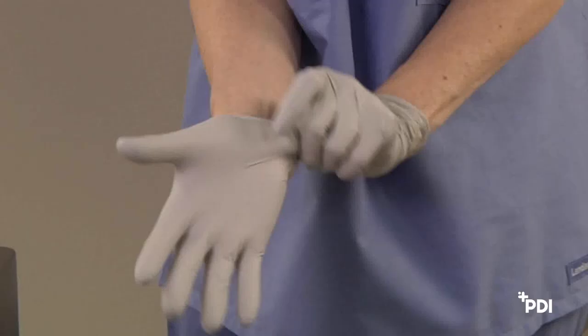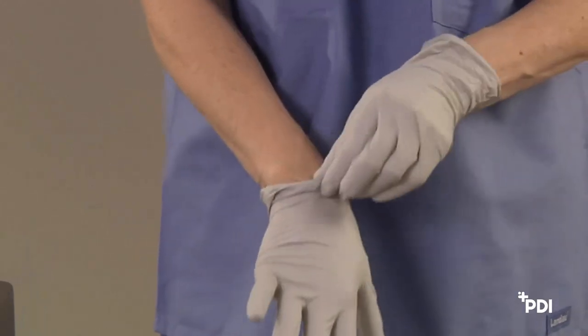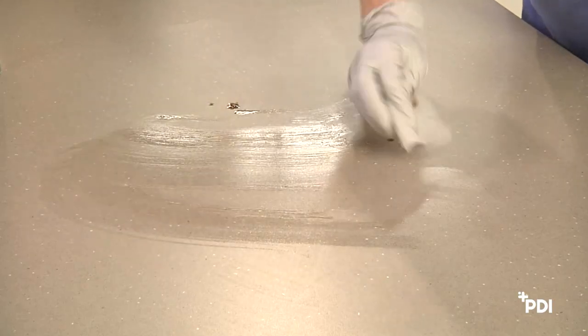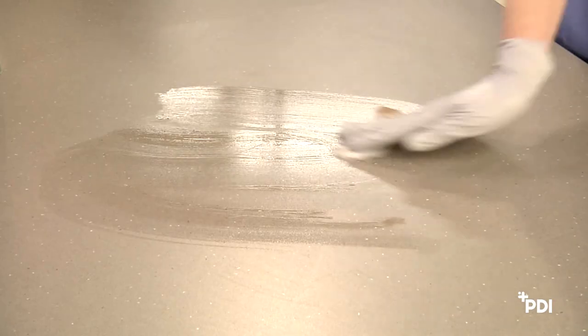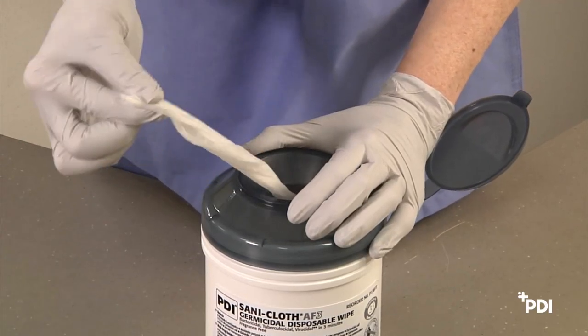When using Sani-Cloth AF3 germicidal disposable wipes to clean and disinfect blood and bodily fluids, be sure to wear gloves and other personal protective equipment as appropriate, and always dispense wipes through the canister lid.